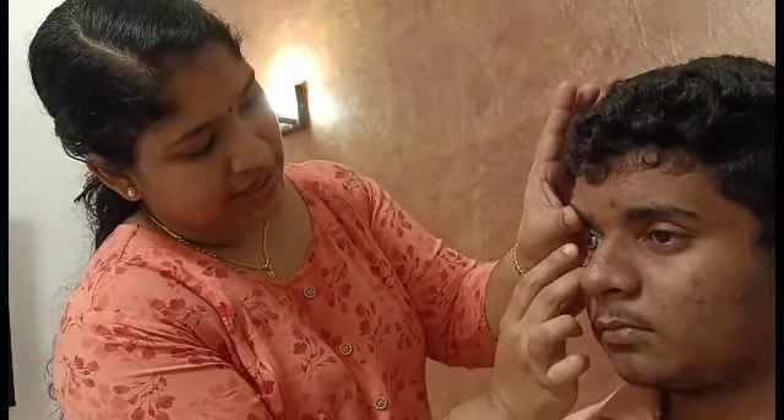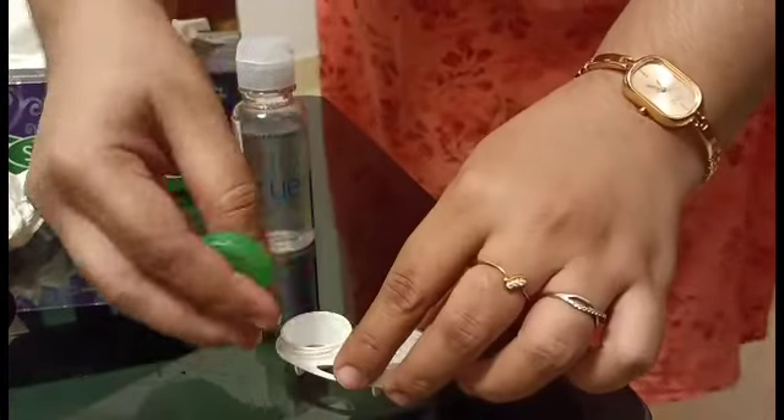The last step is removal of the lens. Use the pinching technique with the right hand. Slide the lens slightly into the temporal direction, then pinch it to remove it. Use solution on the lens before storing it. Close the lens case and ensure the lens is properly removed and stored.